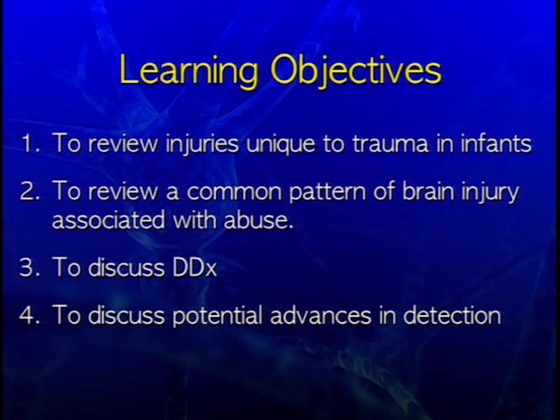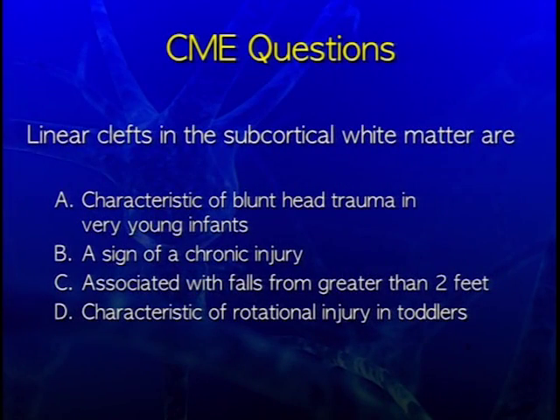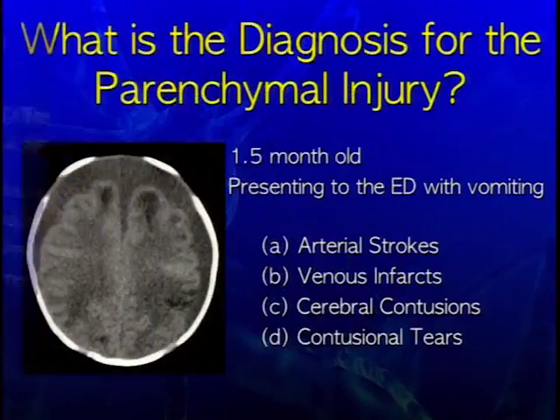And throughout the imaging protocol, I'll be showing some of the newer techniques, in particular arterial spin labeling, which is one of the techniques we find most useful. And I gave some CME questions that you can find, I guess, later on.